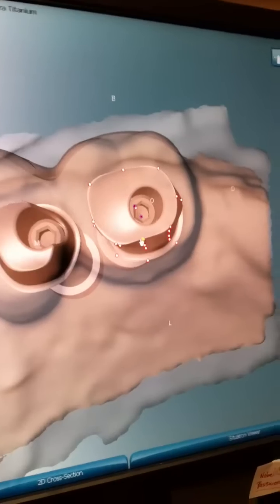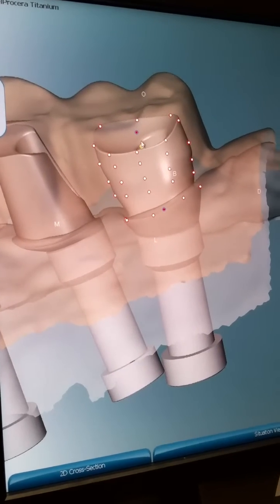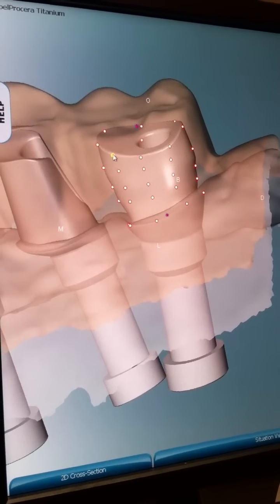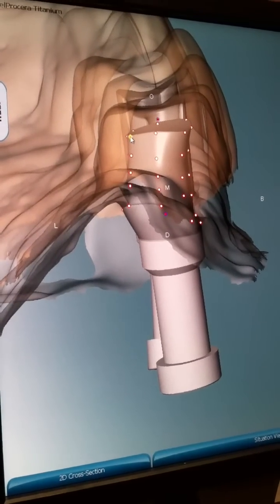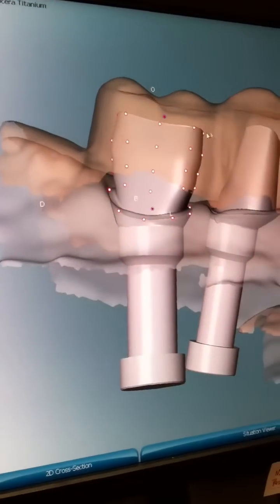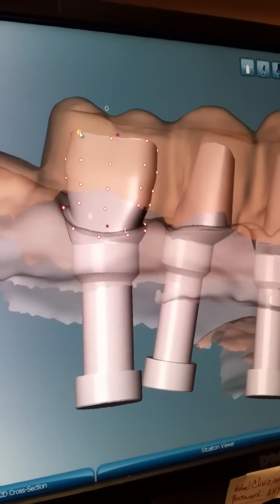Can you see the future prescription pads, maybe including some of that in there with each abutment to give you more of an indication of what we're seeing, or maybe even just a short video, with the placement of the abutment, so you can see how the tissue reacts to the impression copings? It would be really nice. I wonder if there's technology that would make it easier for us to do that.